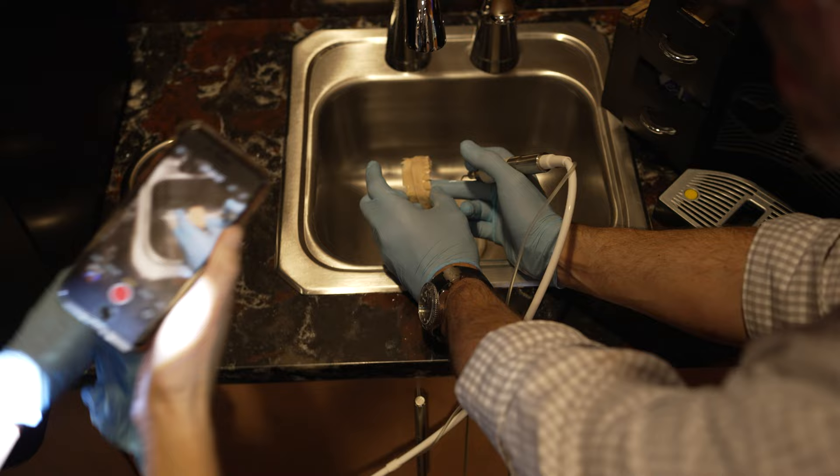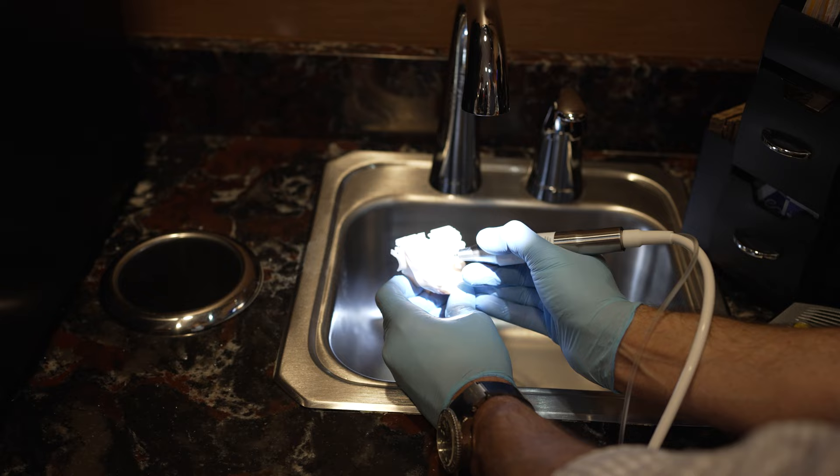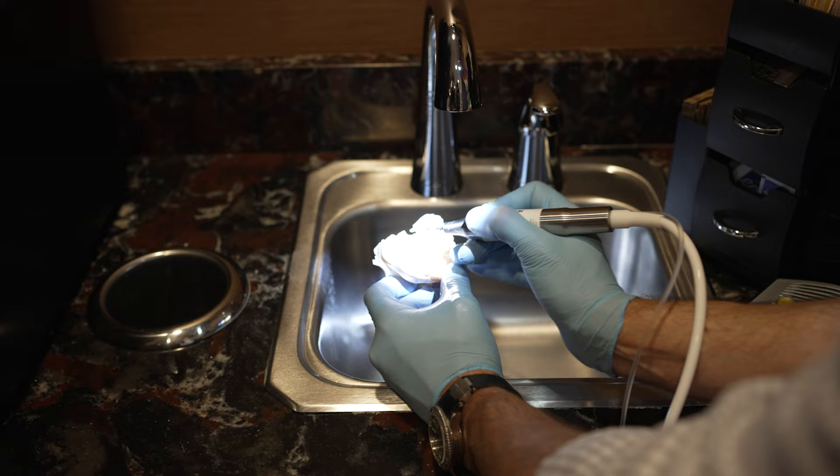You're primarily releasing the major bulk of the cortical bone, and that's where most of your resistance to expansion is. I've experimented a few times — I did just a nasal cut, and a couple of times just a palatal cut, and I know they're both working.